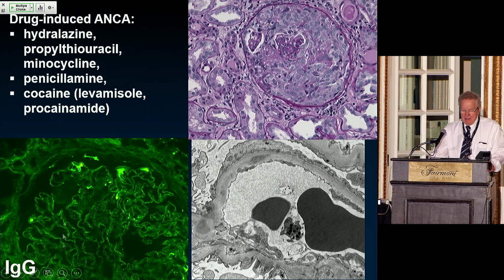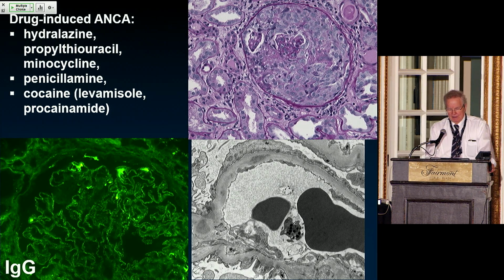In this case, we have immune deposits in the mesangium and along the subendothelium in this patient with an otherwise ANCA-driven disease. But the immune complexes that are also present are hopefully telling you that you should look for other autoantibodies in patients like this: antihistones, ANA, anti-double-stranded DNA.